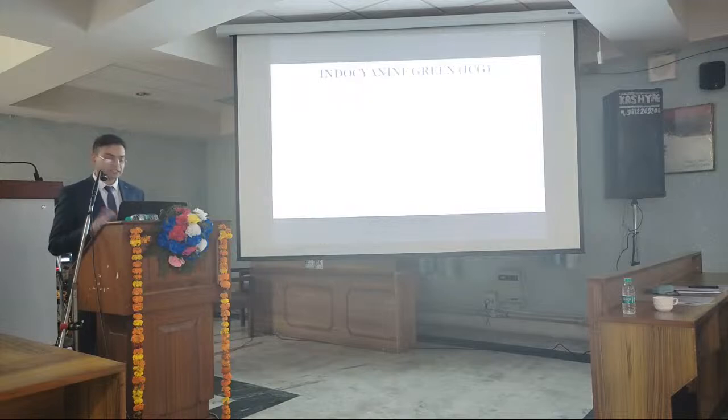There is also the cost of the infrared device and the cost of the indocyanine dye. The per vial dye cost is very high. Another important disadvantage is that ICG for use should be freshly prepared. If it is not freshly prepared, the sensitivity will be low, in the range of 60 to 70%.